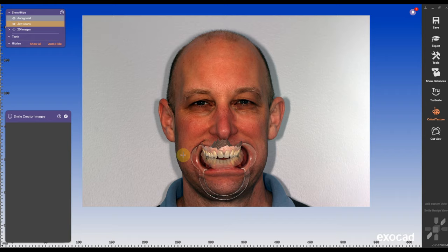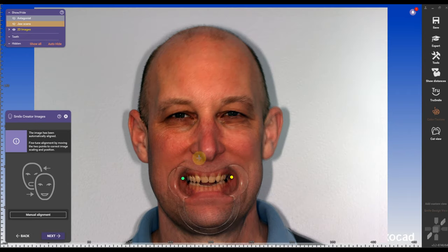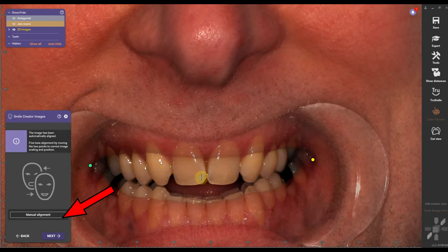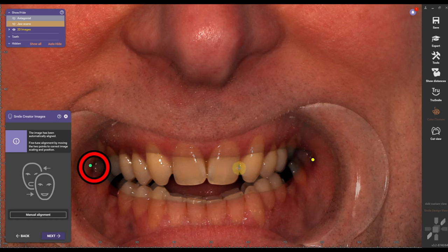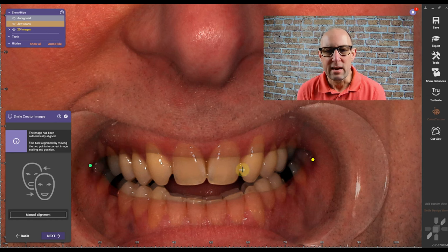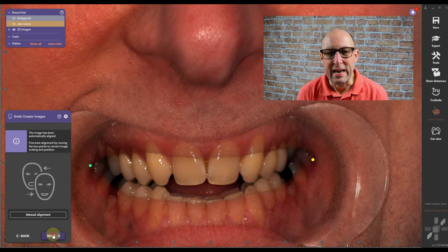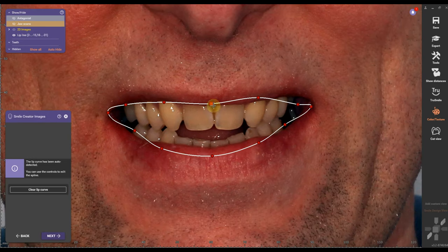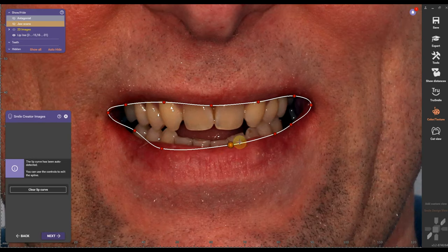Don't have the patient move while you take the smile photo. Take the retractors in and then XOK will do a fantastic job aligning it. You can also manually align the two pictures with the green and yellow dot, and then we're gonna move on to our lip line outline.